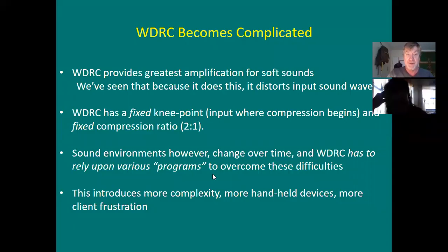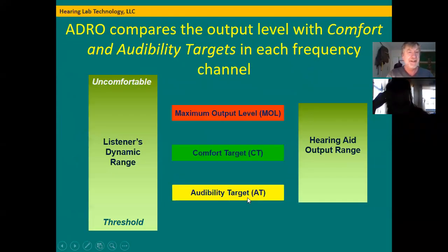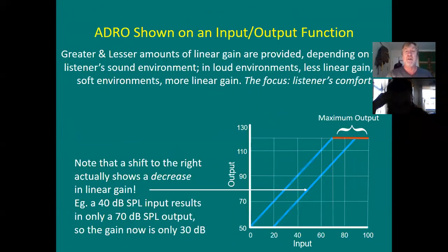It's constantly updating. Those targets are built into the hearing aid or are saved onto the software of the hearing aid. And then the hearing aid is automatically changing. It's changing during speech or all situations? All situations. You're asking a good question, but let's just look at the slide here again, because this is a trip. So I'm going to go back to this here.